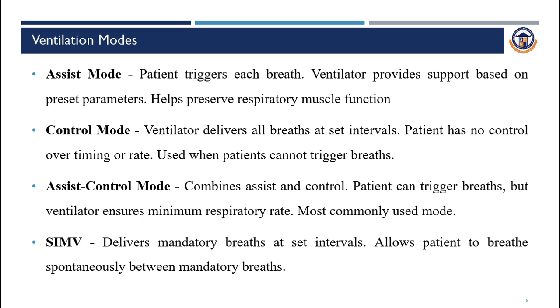Modern ventilators offer dual modes that can switch between pressure and volume, which are targeted to optimize both lung protection and gas exchange. The choice of mode depends on the patient's condition, lung mechanics, and therapeutic goals.